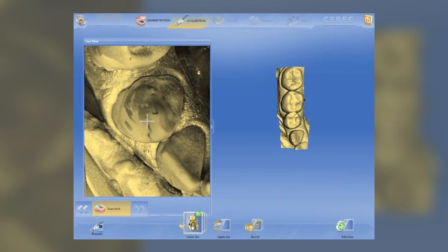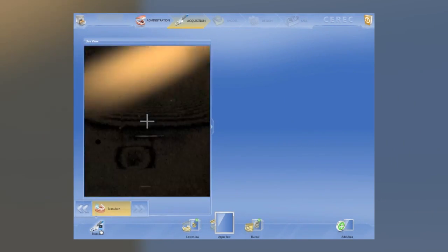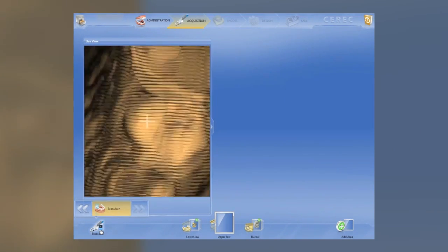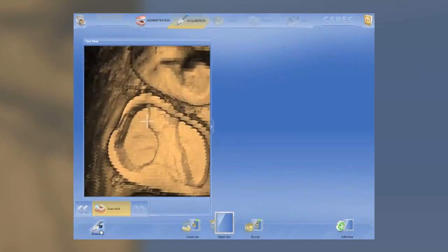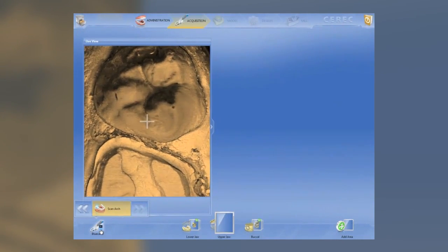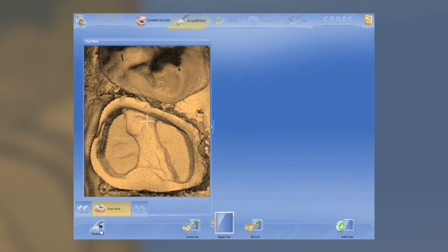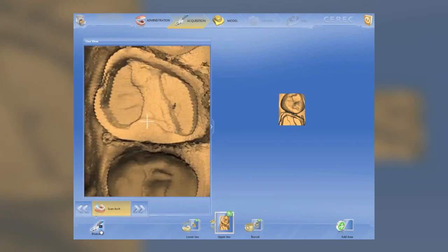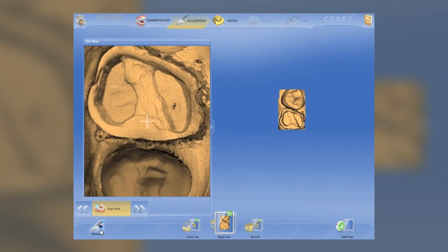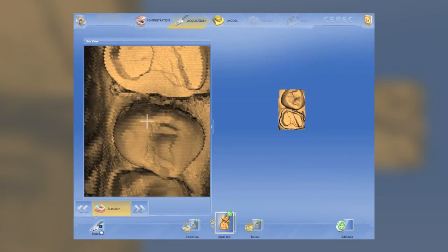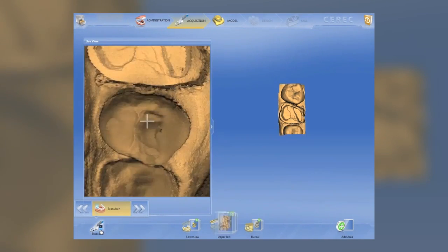We'll go ahead and capture the optical impressions for the preparation. I usually start with the second molar. Remember, the biogeneric software derives its anatomy from the distal tooth. So it's really imperative that we capture as much information from the adjacent teeth, particularly the distal ones, so we can get the best proposal possible. We want to make sure we capture the information below the height of contour from the adjacent teeth that we're going to be developing contacts to.